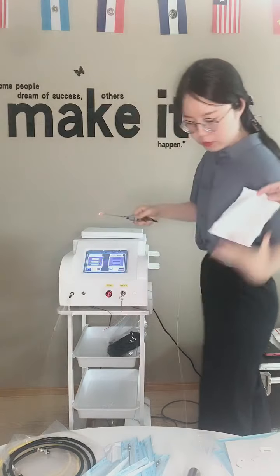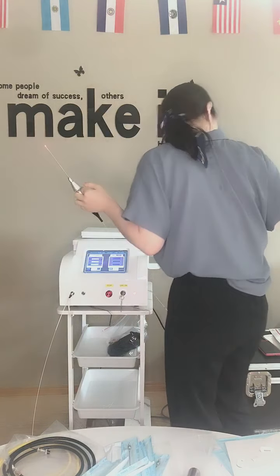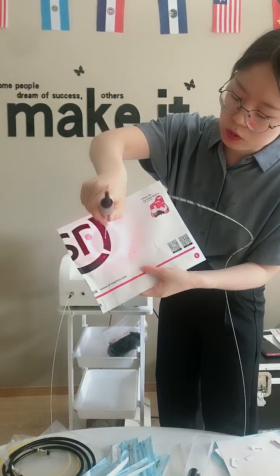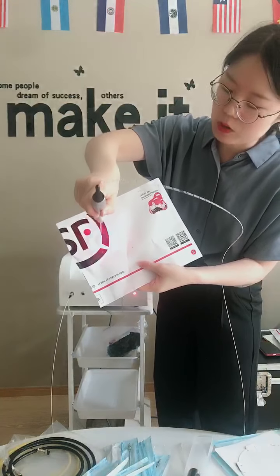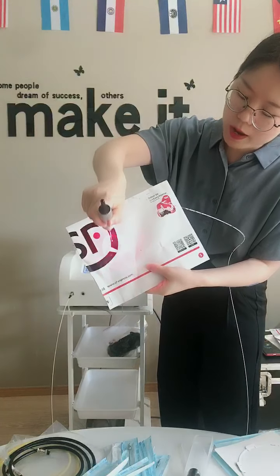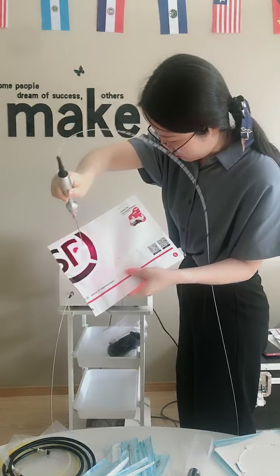You see here? You see the difference? This is the difference between the optical fiber and the radial fiber. On the radial fiber, just now you saw there is the red part. But this is a circle. You see it's a red circle. There's a difference between the optical fiber and the radial fiber. And the radial fiber, this one is for hemorrhoids. So like this. Now let me work it and you can see how it looks.